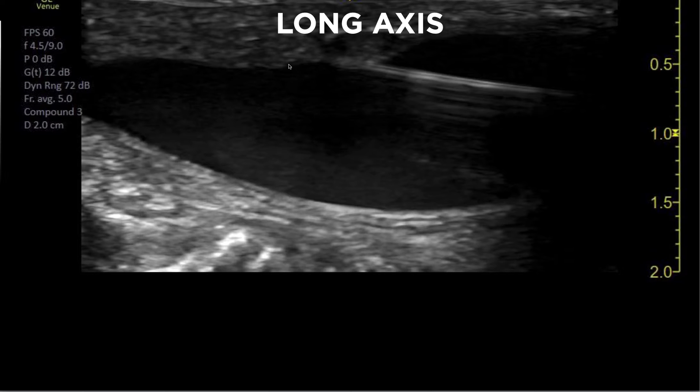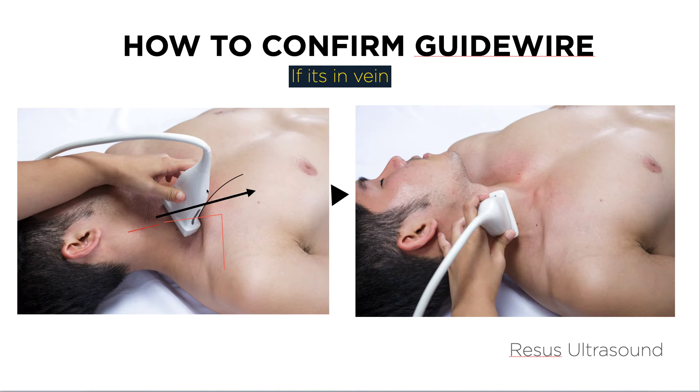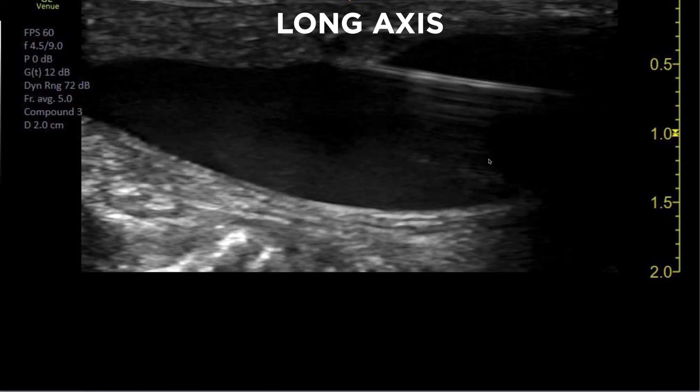The second view is the long axis, which is pretty straightforward. You put the probe in the long axis — I don't have a photo here, but you rotate the probe 90 degrees and then you see the wire like this. This is the longitudinal long axis view, and this is the wire of the central line.